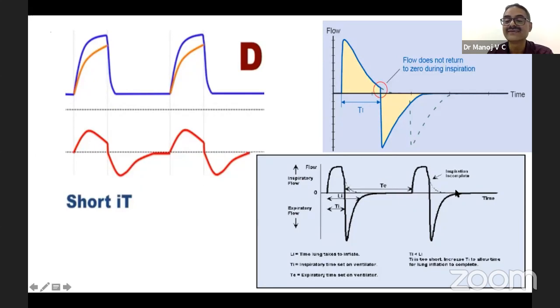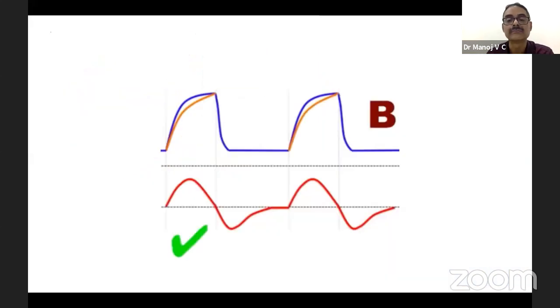The figure is self-explanatory. You would like the lung inflation time and inspiratory time to be exactly the same. So the answer to our poll was B, where we had perfect timing after inspiration before the expiration began, and then after that, depending on the baby's breath or whatever the reason, you wait for the next time for the piston valve to close.